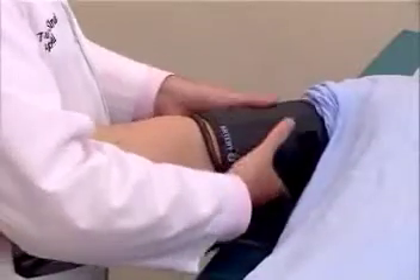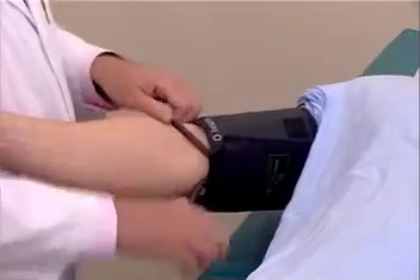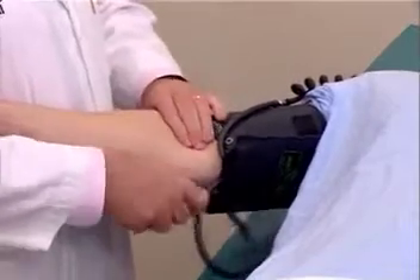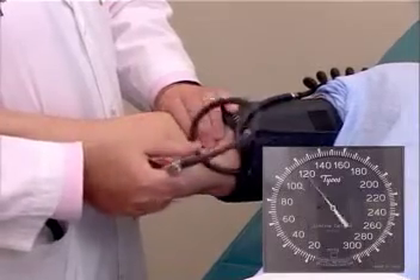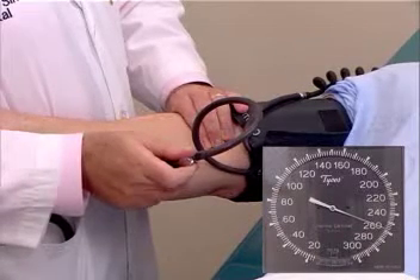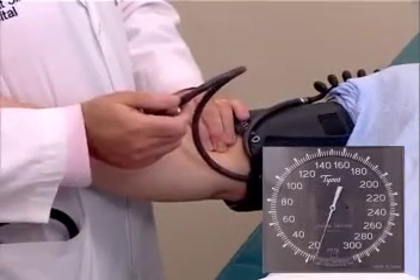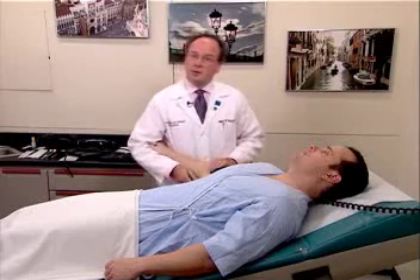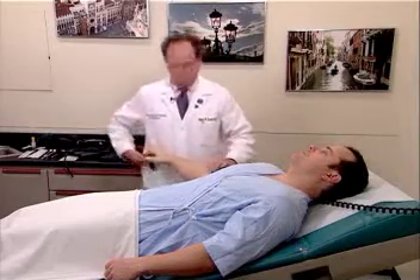The first blood pressure is always assessed by palpation. Notice that the cuff is applied with a lower border about one inch above the antecubital fossa. One can place either thumbs or fingers on the brachial artery and inflate the cuff rapidly all the way up to about 240, 250, 260 millimeters of mercury, and then rapidly reduce the pressure. We do this to rule out an auscultatory gap, which is very common. After we've ascertained the peak systolic pressure, which was about 120 in Mr. Johnson's case, we will now do blood pressure by auscultation.